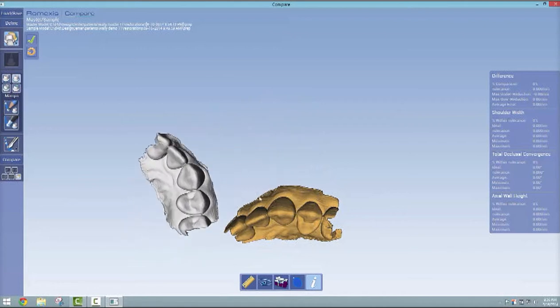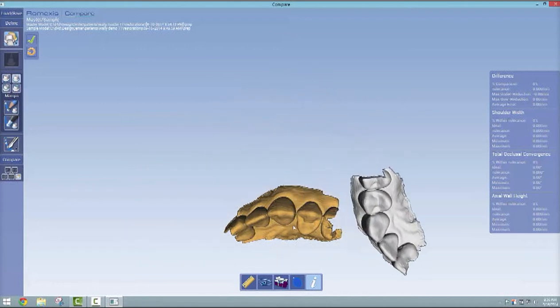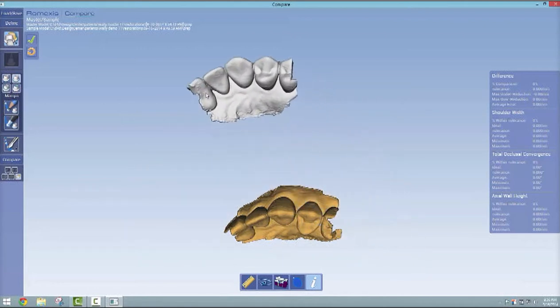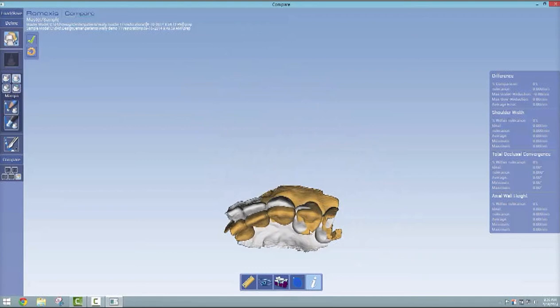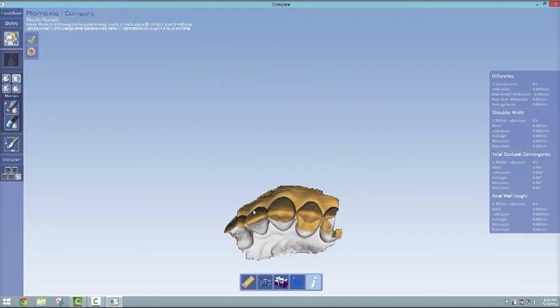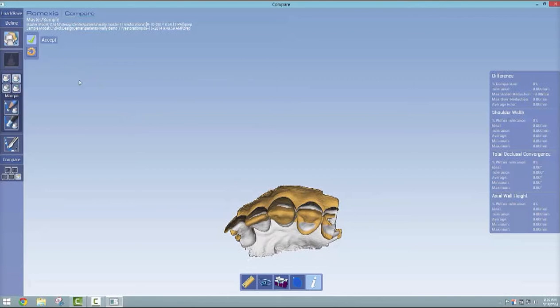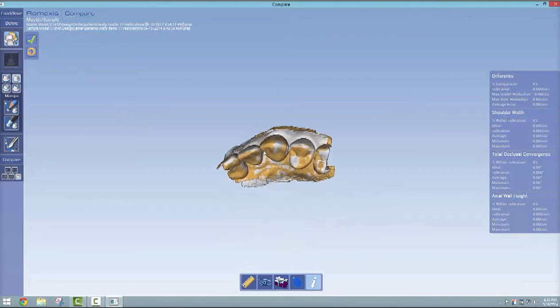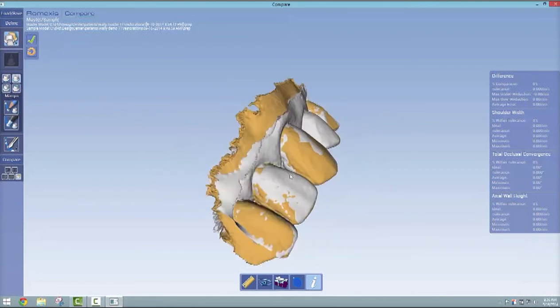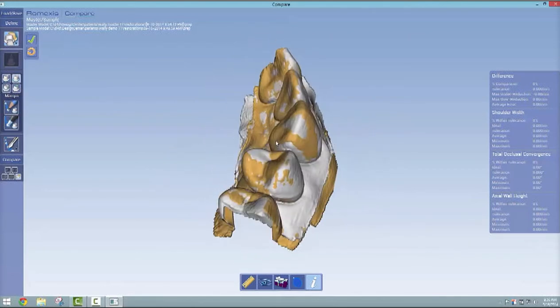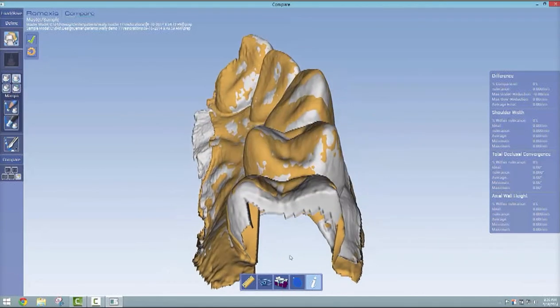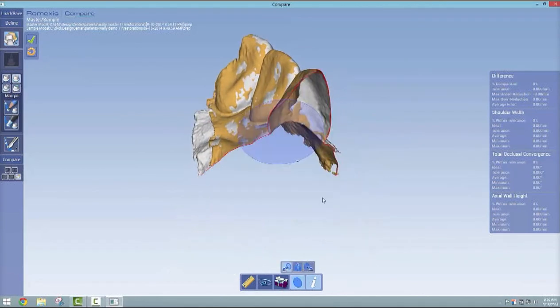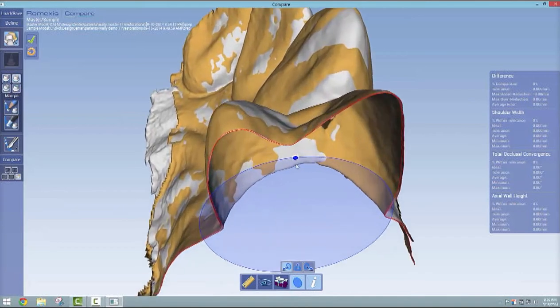Definitely not perfect here, and you don't need to be. If you click in the middle it goes straight down, if you click on the sides it turns. You want to maybe drag it from the middle tooth, then fine-tune it by clicking on the edges and you can rotate it. The checkmark will do the rest for you. Now we have a better adaptation of those two separate and distinct models from those two scans.